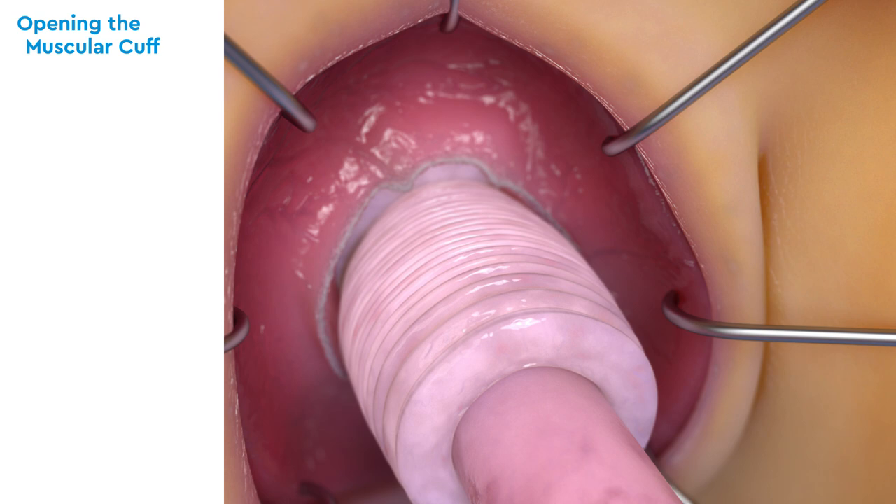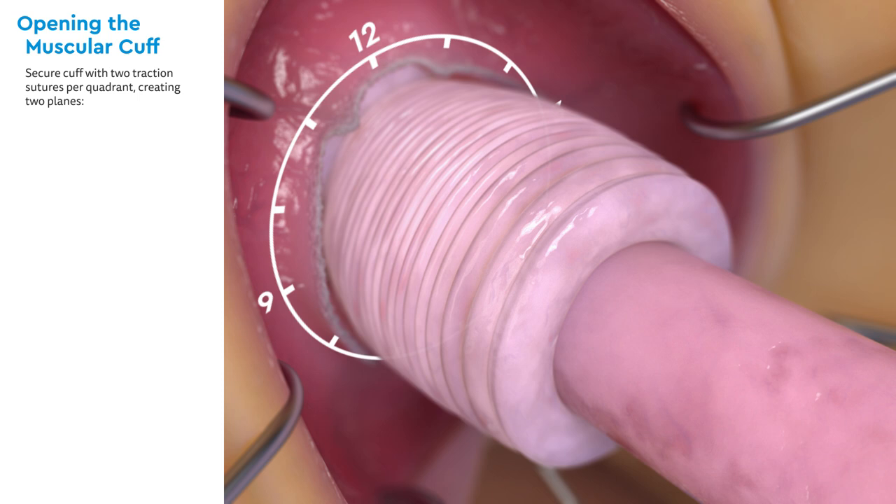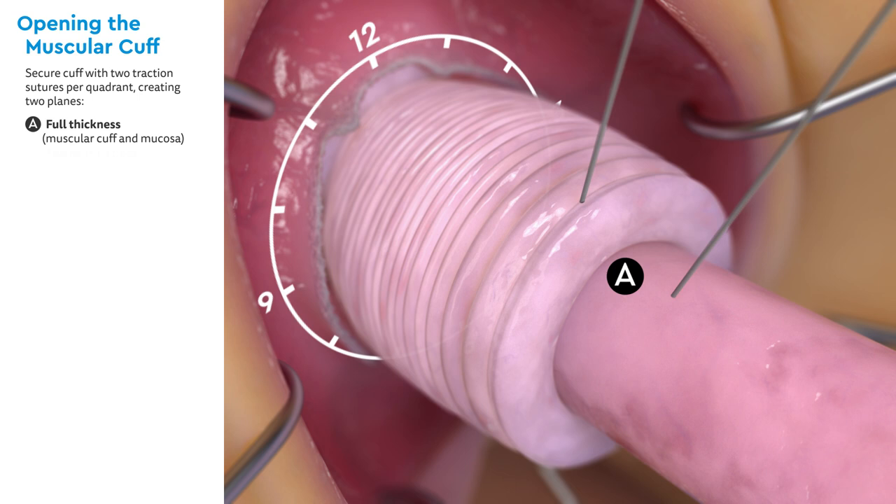Next, the muscular cuff will be opened, separating the muscular cuff from the mucosa that is attached to the sigmoid. Four pairs of traction sutures will be placed at the 3, 6, 9, and 12 o'clock positions. The muscular cuff is secured with two traction sutures per quadrant, creating two planes.